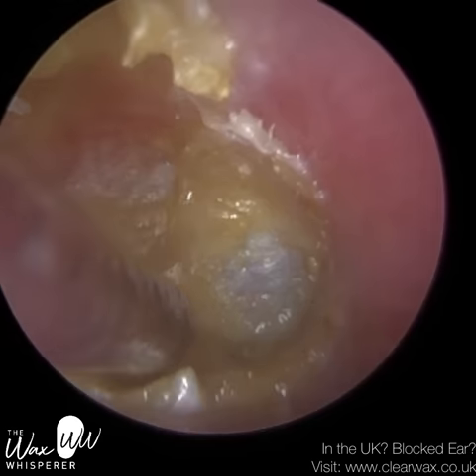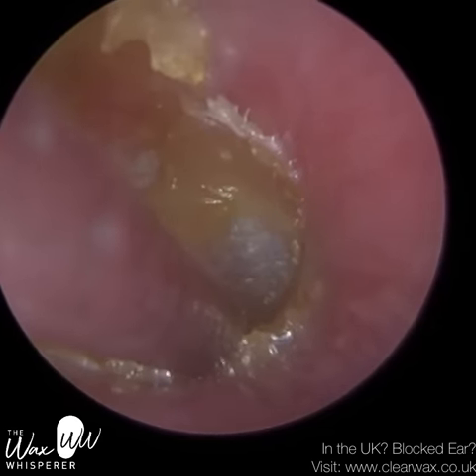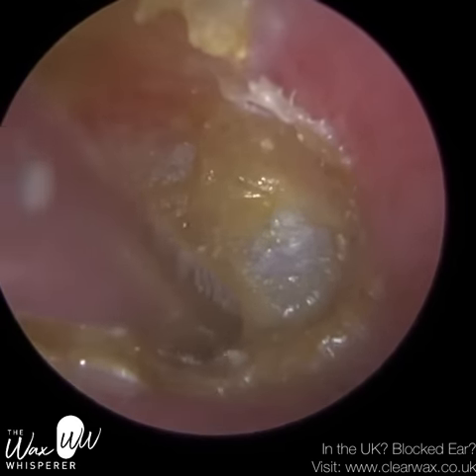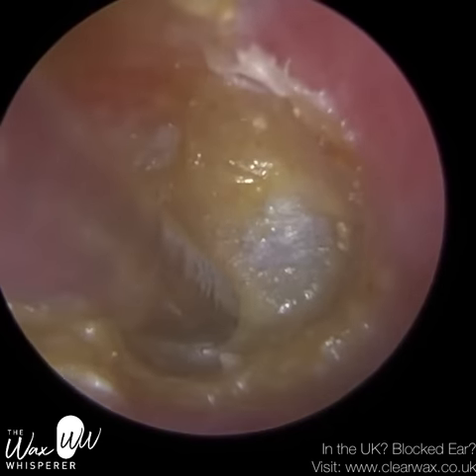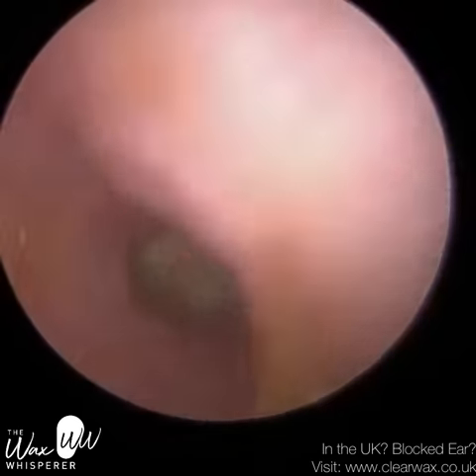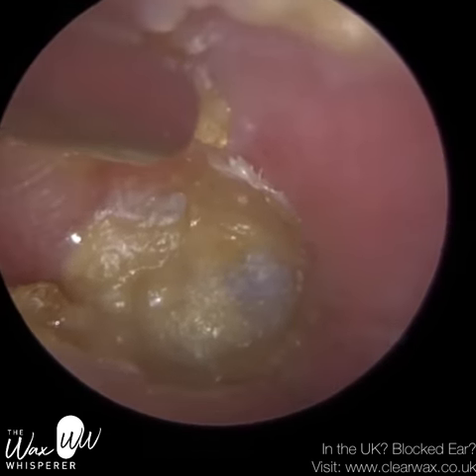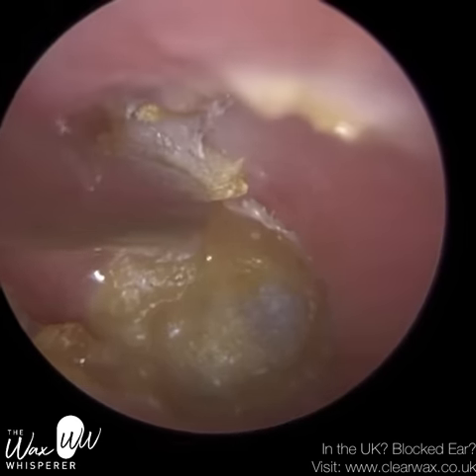You may have seen the patient flinched and I had to come out — that's because the canal had collapsed again. When the canal collapsed, I was actually into the ear and the endoscope was past that swelling. So we just have to be careful and be wary that it doesn't happen again. You may have also seen the eardrum just flex there, and that's another thing with this mushy consistency of debris and wax — you have to kiss the surface to take it off the eardrum, which can cause the eardrum to flex.